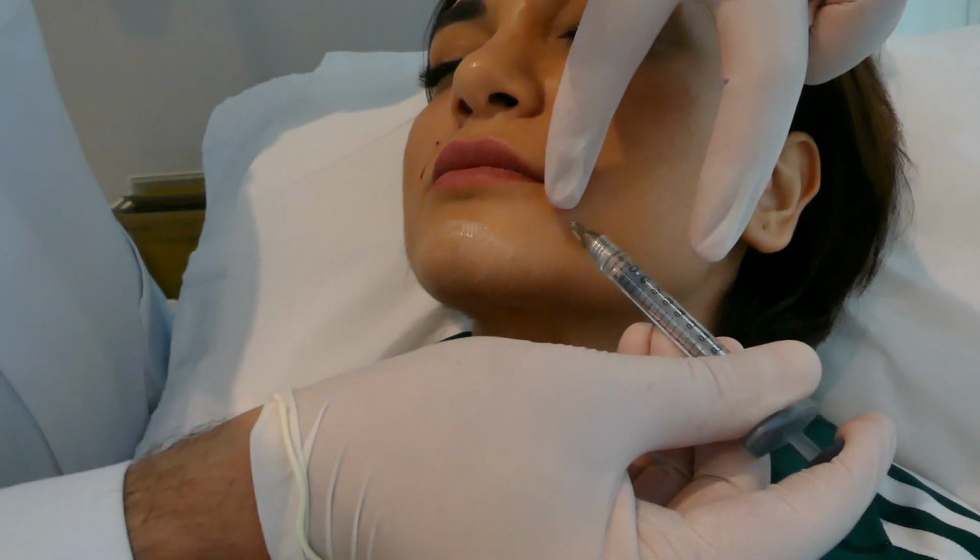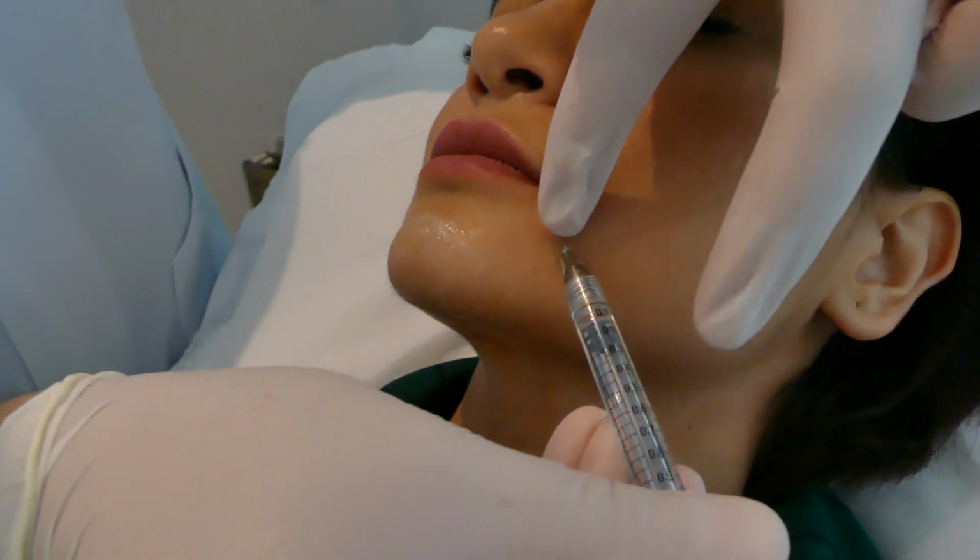This is labiomental injection, small quantity in a radial fashion.